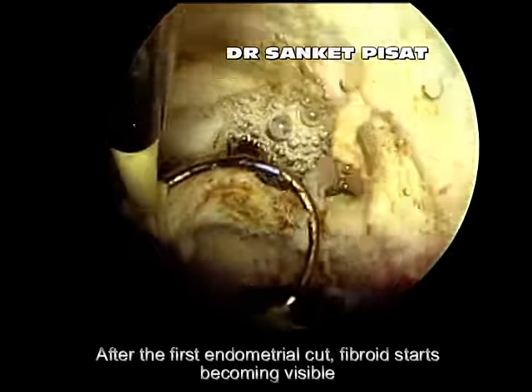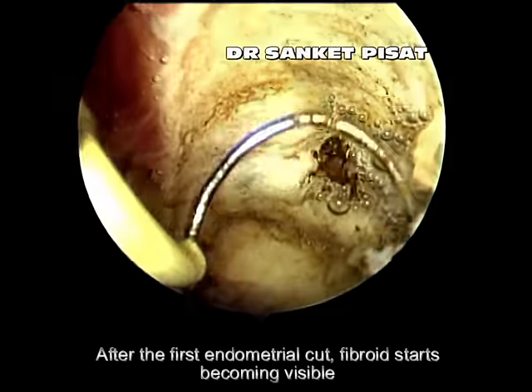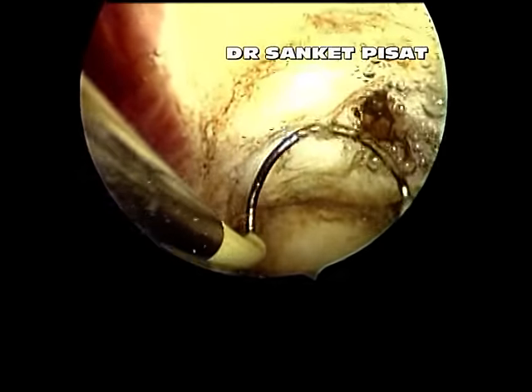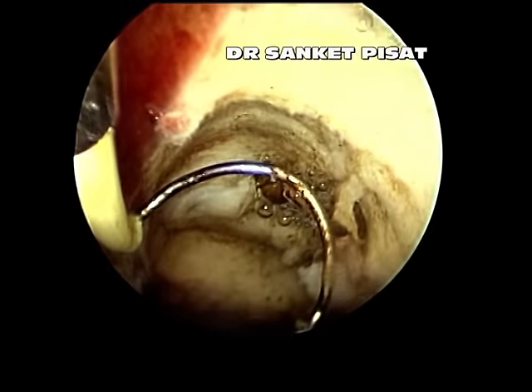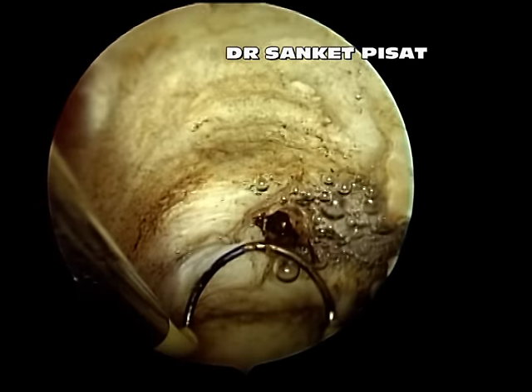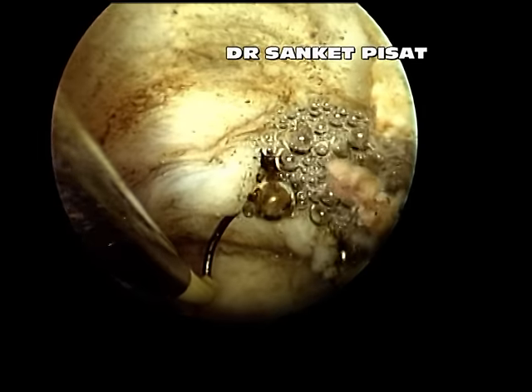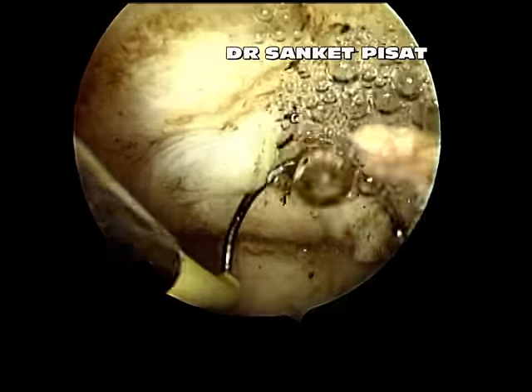It is only after the first 1 or 2 cuts on the endometrium that the fibroid starts becoming visible as a diffuse elevation over the anterior wall. Following the same principle as discussed earlier, rather than dissecting into the myometrium using a burrowing technique and increasing the risk of perforation, the extent of the fibroid is first carefully determined by the operating surgeon.